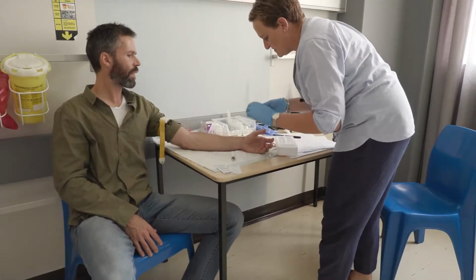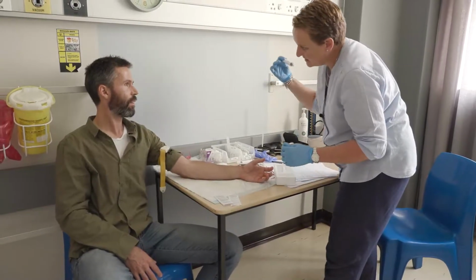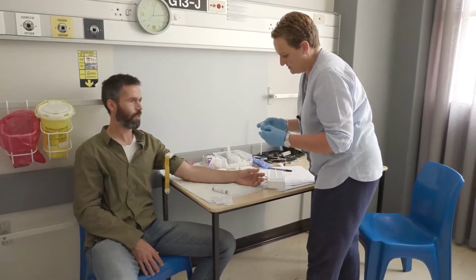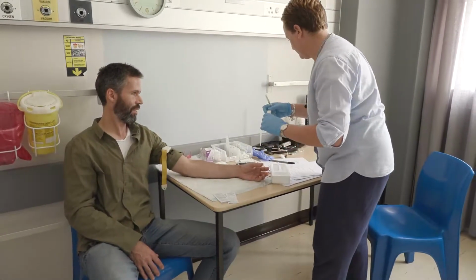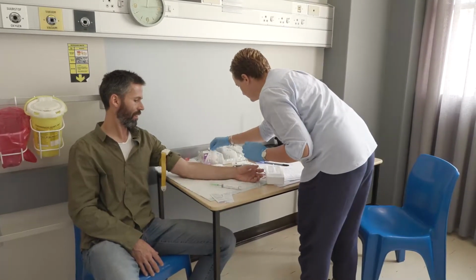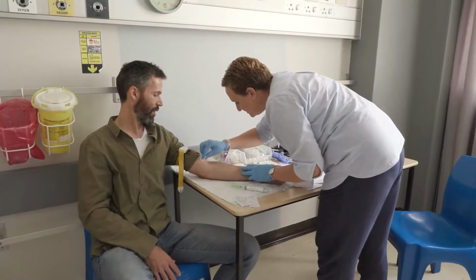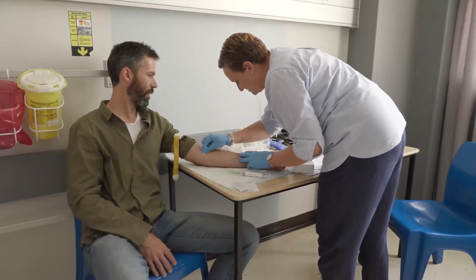What is the blood for again, doctor? So this little vial of blood will go in the kit and then I give it to the police. The police will take it to the lab and then they will check the blood alcohol levels. Okay, in the blood. All right. That should be fine. There's a good vein there. Mm-hmm. I'm healthy and strong.